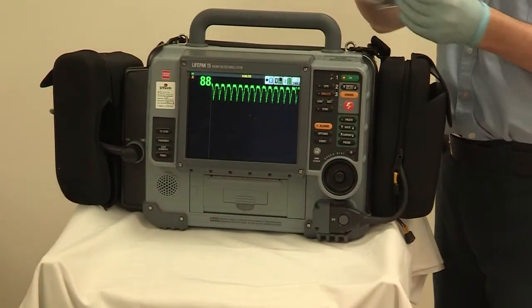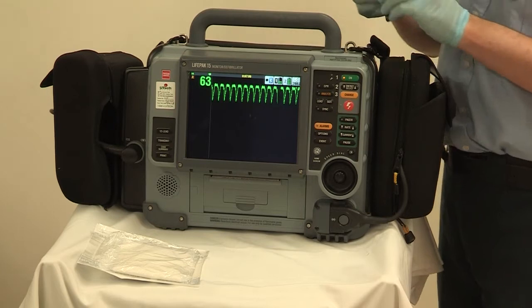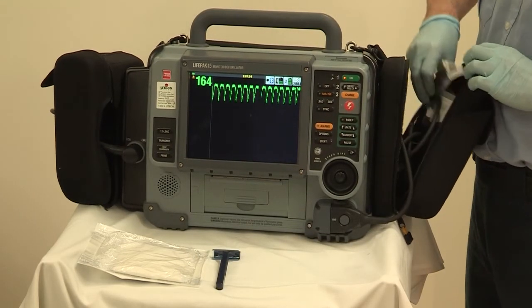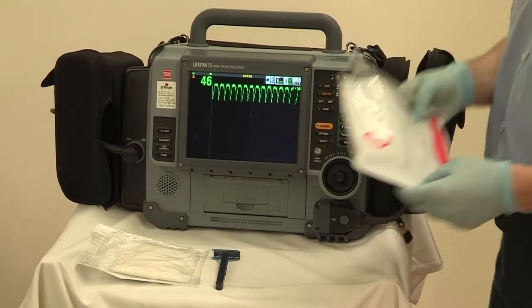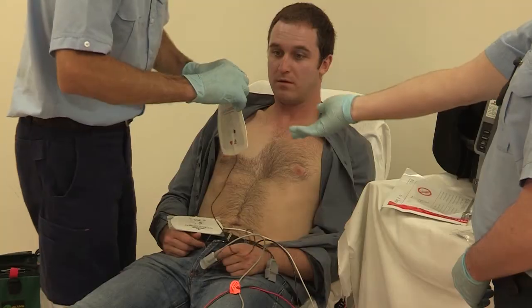In this step, we will show you the two various placements for synchronised cardioversion. This video will not tell you when to do them, but merely explains the process. You will learn the when to in your tutorials. We're going to cover synchronised cardioversion only.